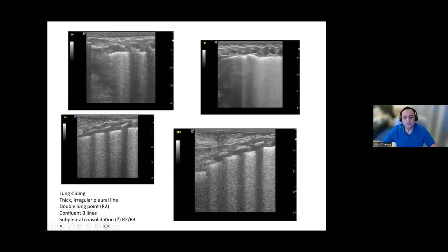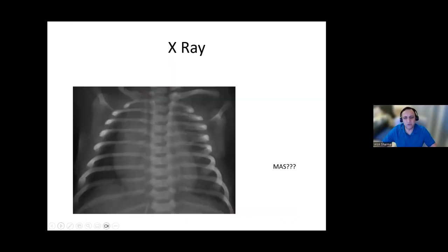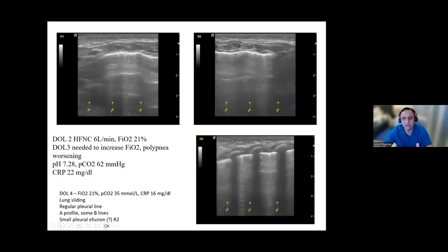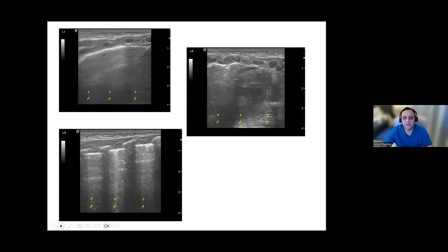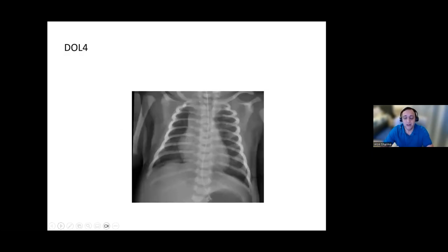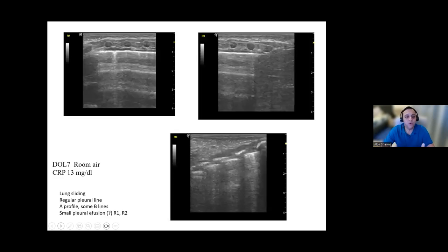So that's beautiful. Now, my question is really the three diagnoses that I would think of in this situation, following the clinical course and the serial ultrasounds. The first would be RDS. You've definitely got subpleural consolidations that were visible early in the clinical course, less so later on because the baby's recovered. Mild RDS would give you exactly this kind of clinical presentation. If I look at the clinical course this baby's taken for TTN, it's just too long for a baby to take such a long time to recover.